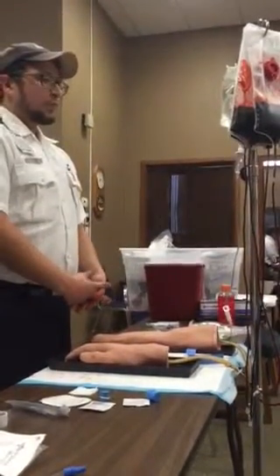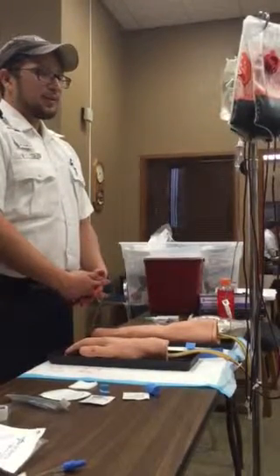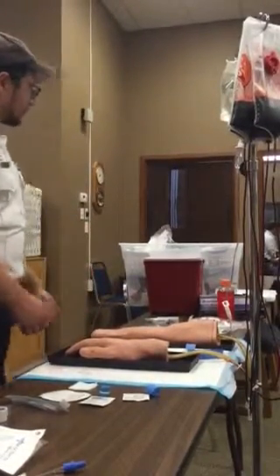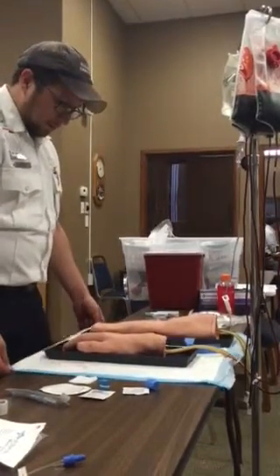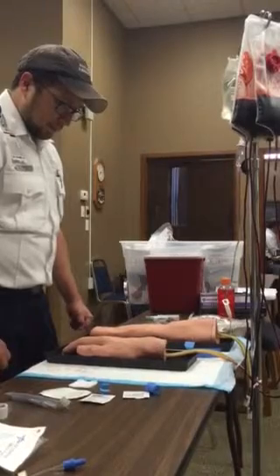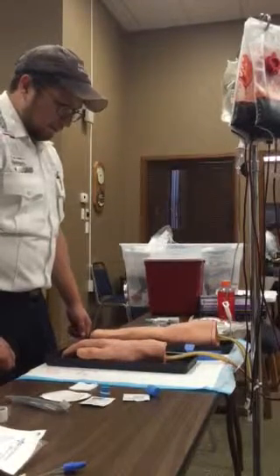Okie dokie. Welcome to the IV and medication skills test. We'll be testing at the paramedic level today. These skills are designed to evaluate your ability to establish venous access in an adult patient and administer an IV bolus of medication. You'll be given a patient scenario and will be required to establish an IV and administer an IV bolus of medication just as you would in the field.